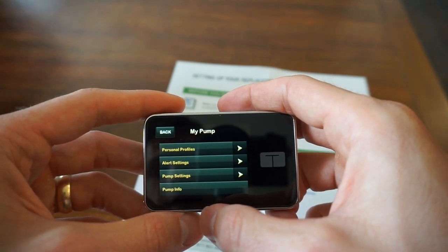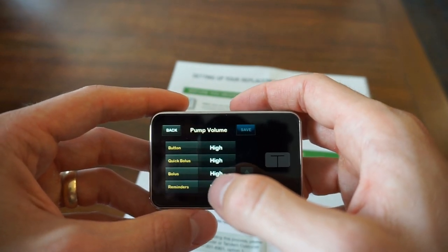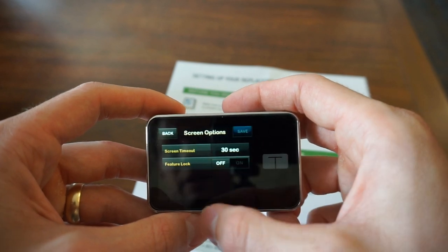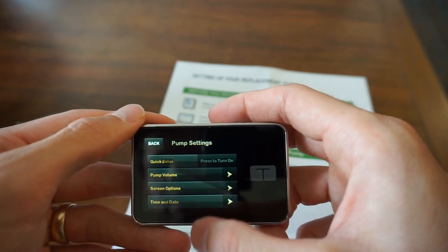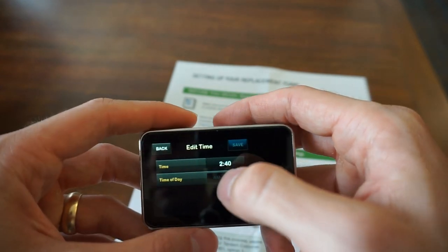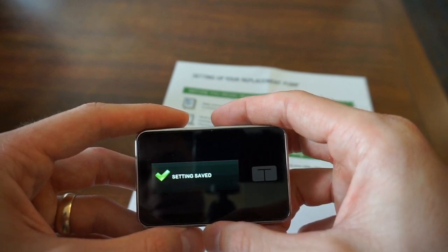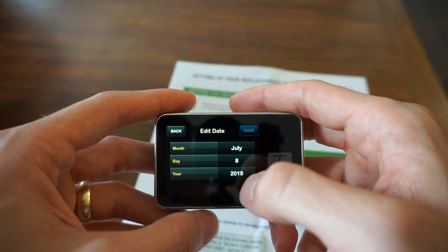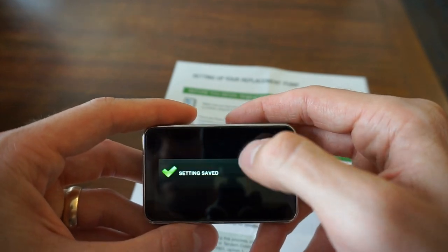There's Pump Info, which has your serial number, and Pump Settings where you can get your time. Quick Bolus — I don't like to use that, personal preference. Pump Volume — I'm going to change all of these over to vibrate or just turn them off. There are Screen Options as well. Time and Date: make sure that's accurate. It was showing 2:40 but it's actually 3:25 right now, so I changed that. I don't think military time is an option, so just going with standard. The date was also incorrect — it is August 1st. It'll be a couple days later when I upload this, so just know that.